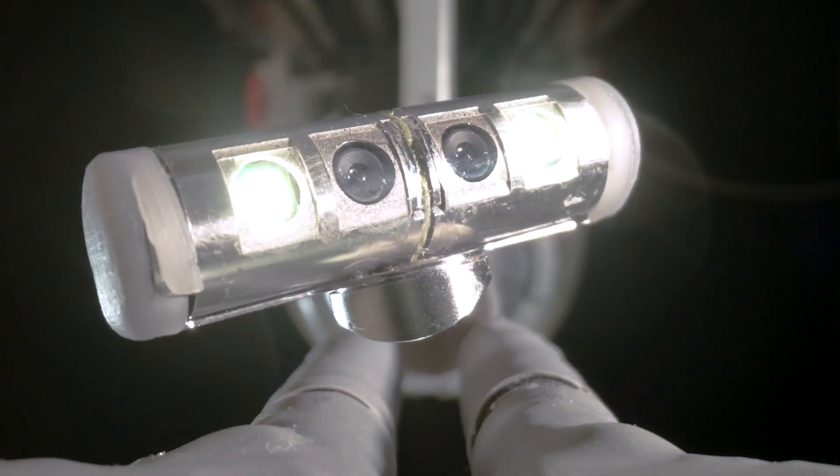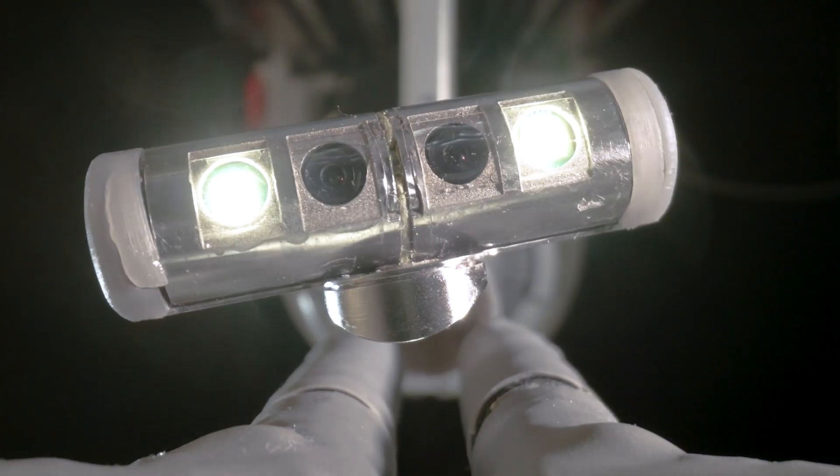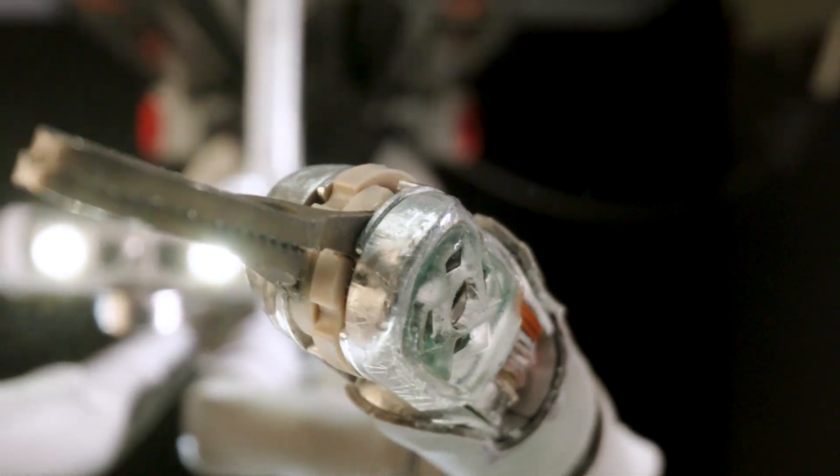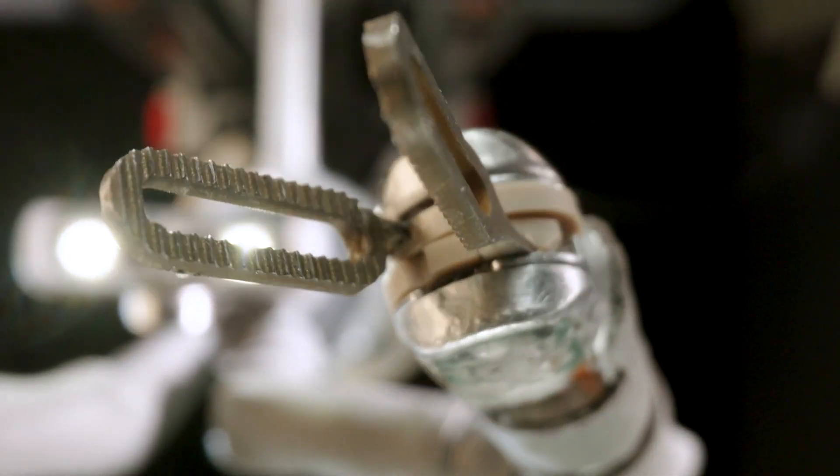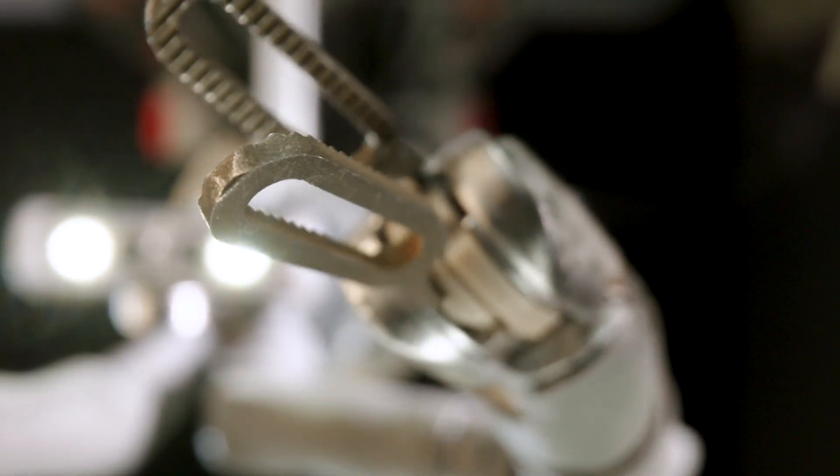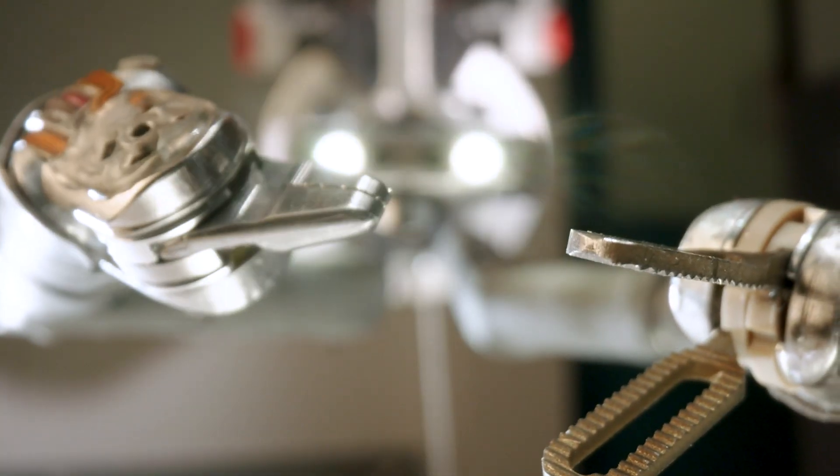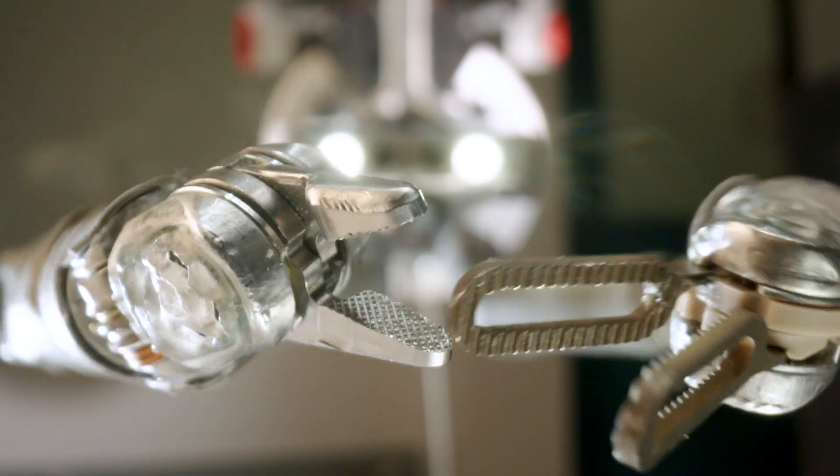Once inserted, the robot's camera and instrument arms are precisely configured for surgeon control, designed to allow for multi-quadrant access to patient anatomy.